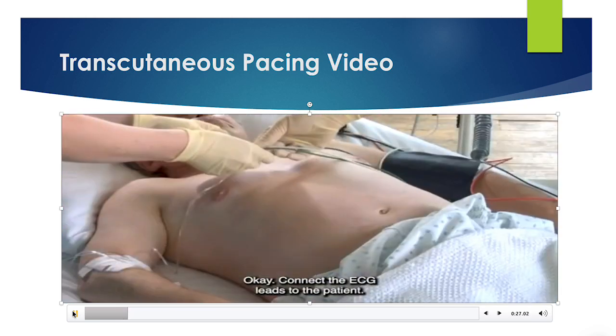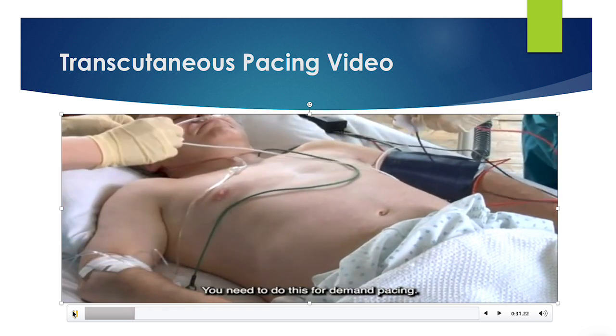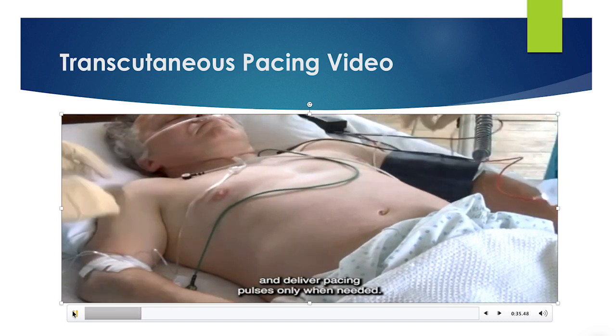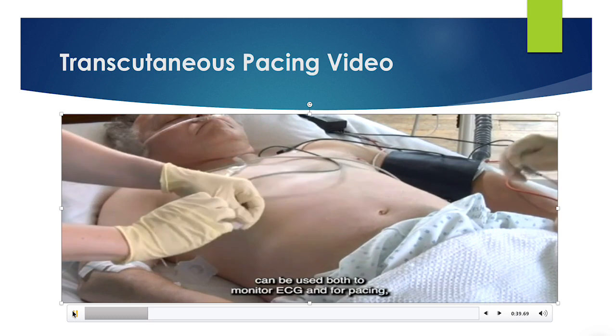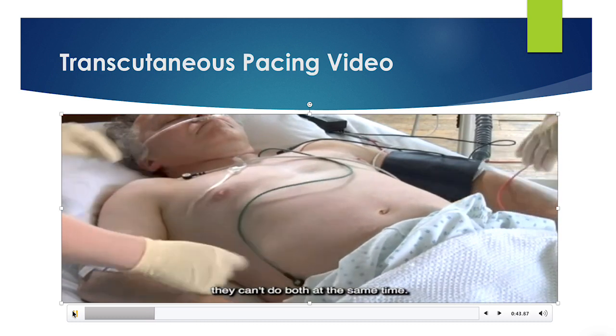Okay, connect the ECG leads to the patient. You need to do this for demand pacing, so the pacemaker can see the patient's own beats and deliver pacing pulses only when needed. Also, although the QuikCombo electrodes can be used both to monitor ECG and for pacing, they can't do both at the same time.